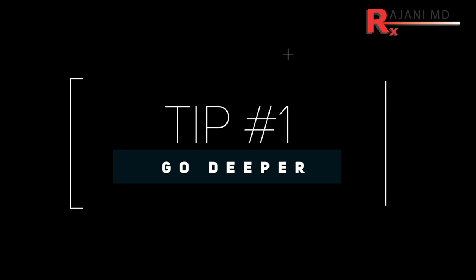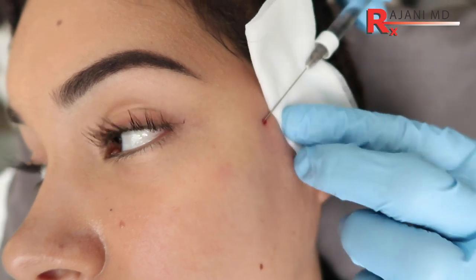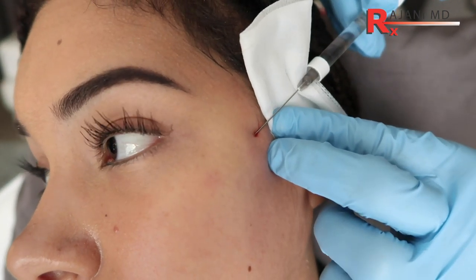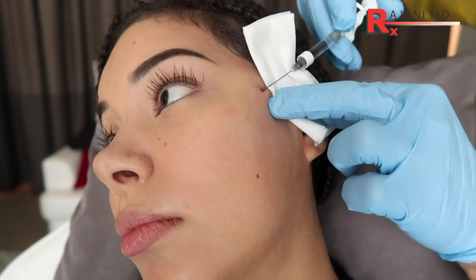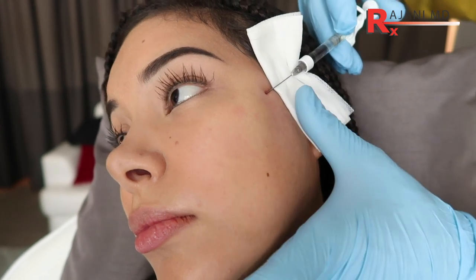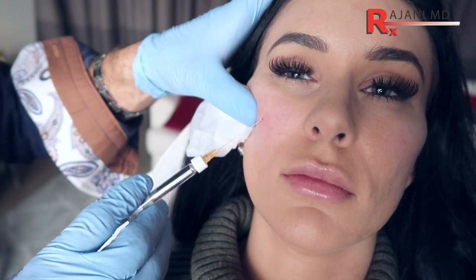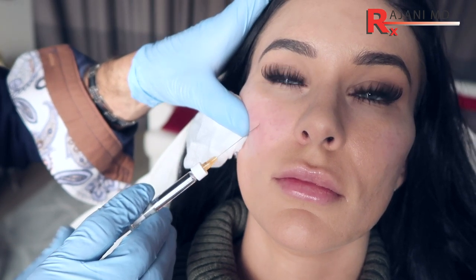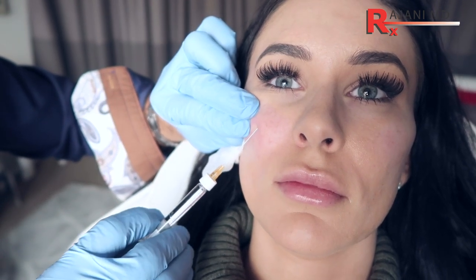Tip number one for the midface: go deeper. The micro cannula is blunt, and I prefer 25 gauge, but you can get to those deeper layers — particularly laterally along the zygoma. Anteriorly you have to be careful lower so that you're not intraoral, but as you move up towards the maxilla, you can be deeper. A lot of people will say the infraorbital nerve is there, and the patient will tell you when you're deep along the infraorbital nerve.